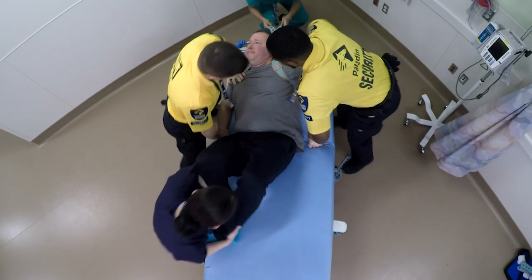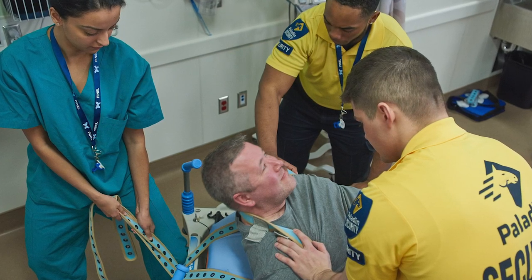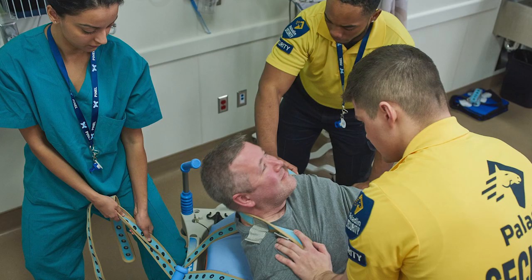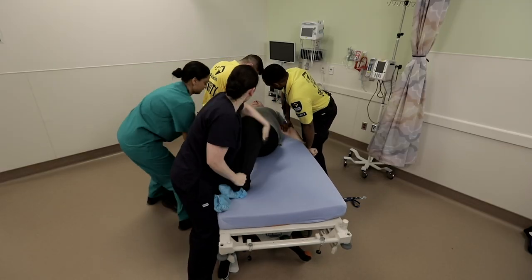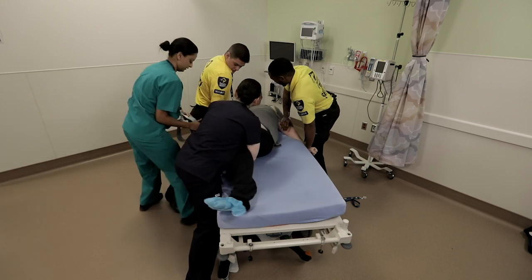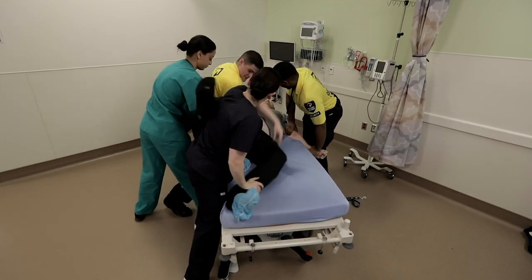The team leader is positioned at the head of the bed in order to communicate with the patient. In this position, the leader is also able to monitor the patient's stress reaction by observing facial expression. All other members should avoid eye contact with the patient. They are responsible for controlling the limbs.